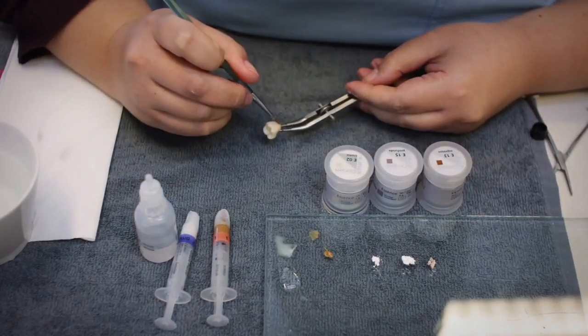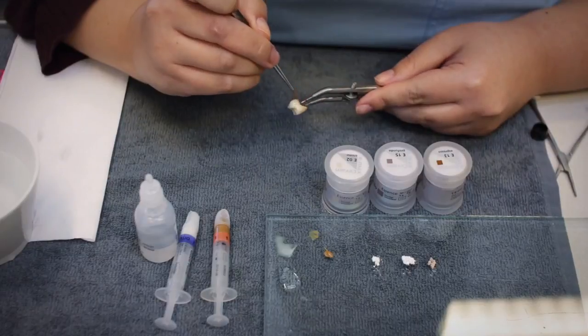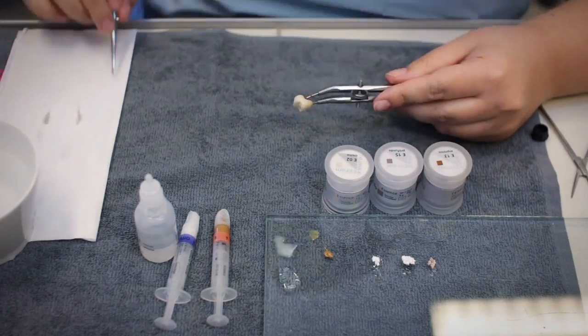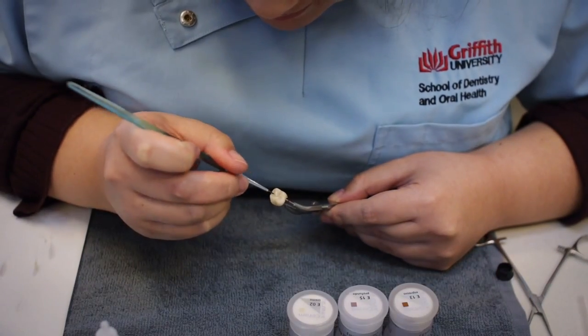After glazing, stains are used to create unique characteristics on the occlusal surface. Dark stains are placed in the fossa and lighter stains are used to highlight the ridges.